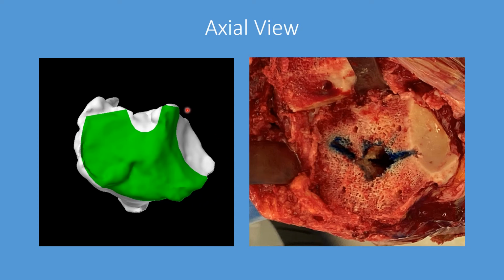I think one of the most powerful things that we can do is that we can virtually image what our anticipated defect looks like so that there are no surprises. And so here is what we had planned on the tibial surface, and we're specifically looking at the area of the defect compared to the cut surface. And this green represents host bone, this crescent represents our defect. And we can see here we pretty much obtained what we had planned at the time of surgery. Healthy host bone, and then a small area for defect in terms of area.